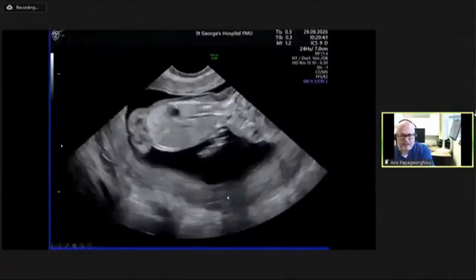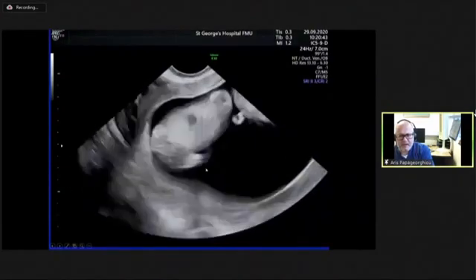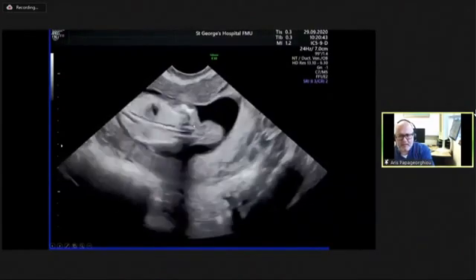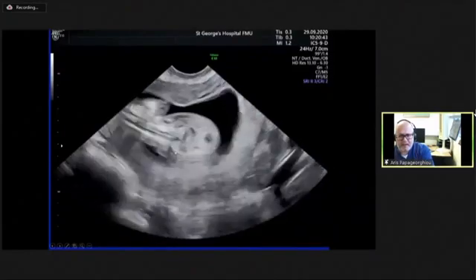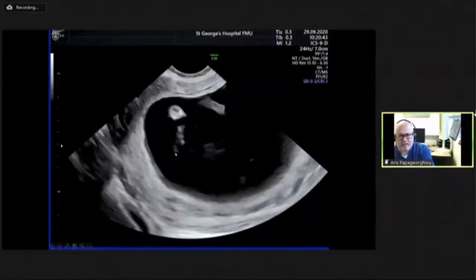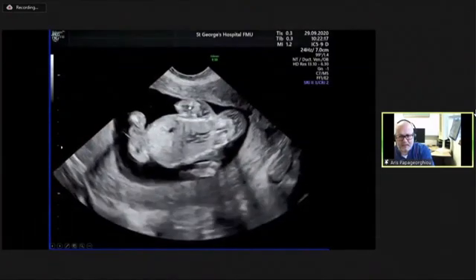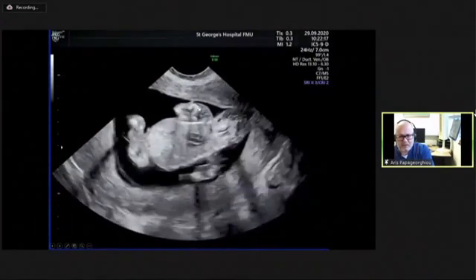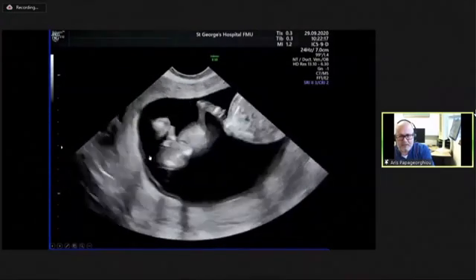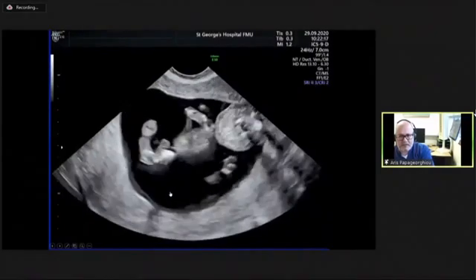So what is this condition now? You're thinking, could it be achondrogenesis, but you've got a normally mineralized spine there? Could it be campomelic dysplasia? Well, you've got normal scapulae there that we were just seeing. Scapulae being normal is against campomelic dysplasia, where one of the signs is absence of the scapulae. And in fact, I can tell you that this, despite the fact that these bones look really short and maybe even telephone receiver-ish, actually was a case of osteogenesis imperfecta type 2.